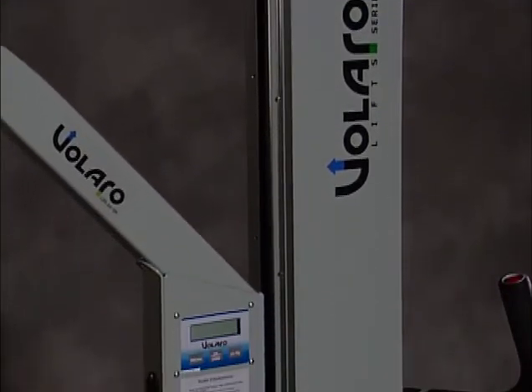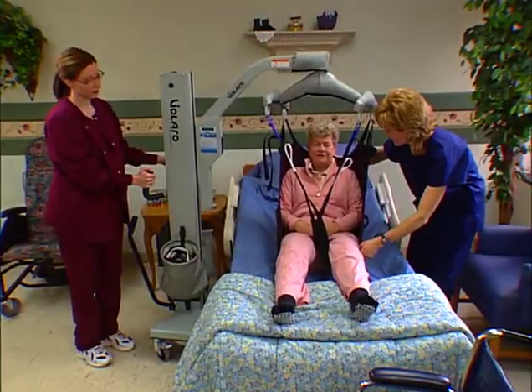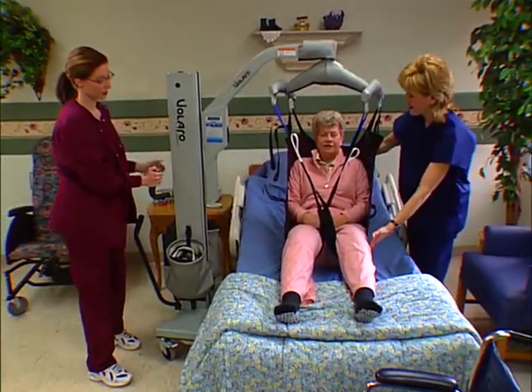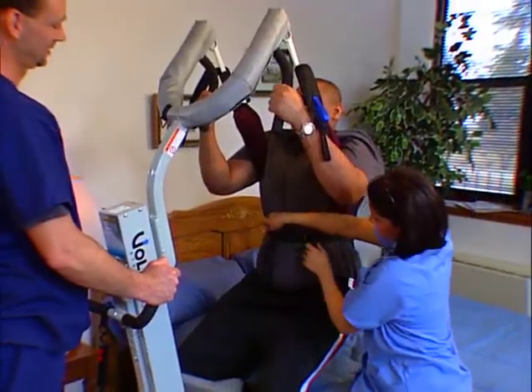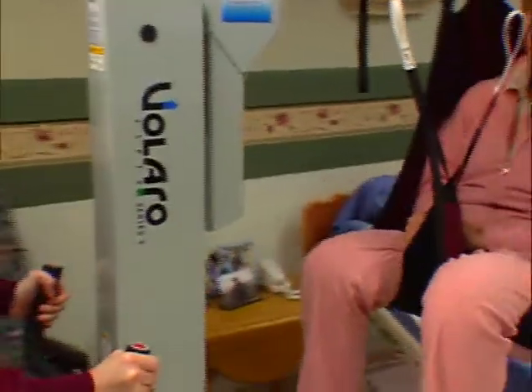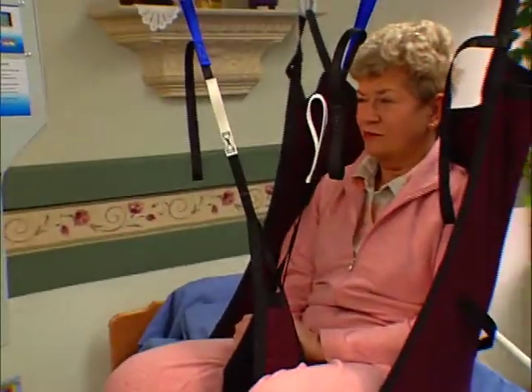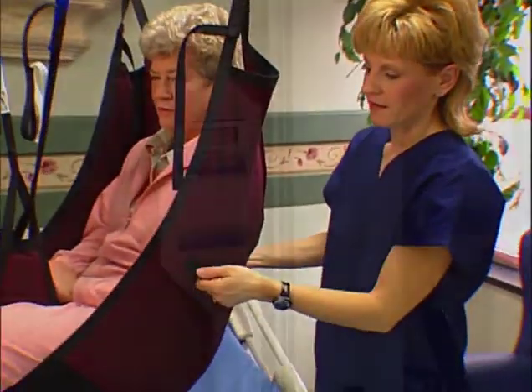Thank you for purchasing a Volaro product from SMT Health Systems. In this Volaro training video, we will walk you through the operation of our Volaro line of lifts, stands, and accessories. As a healthcare professional, you will find that the Volaro line of lifts will make caring for your patients simpler and will help make your resident more comfortable during transfer.